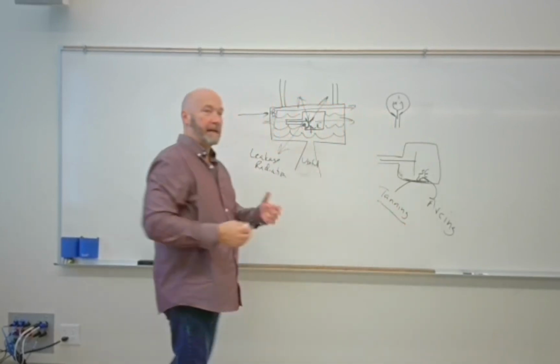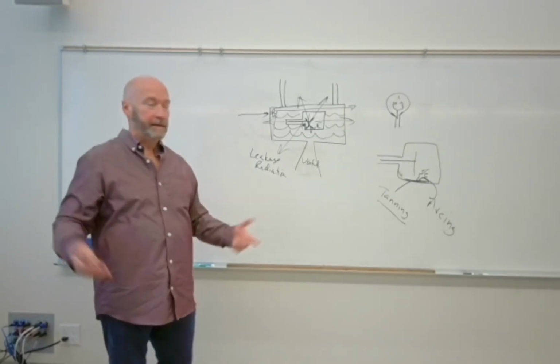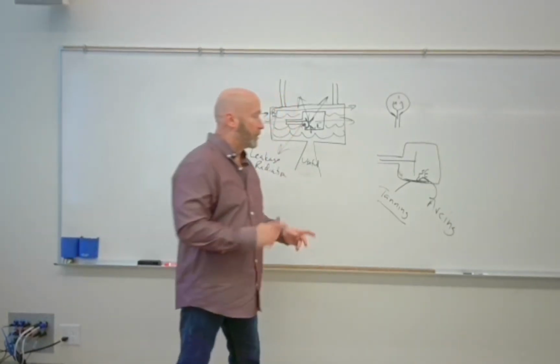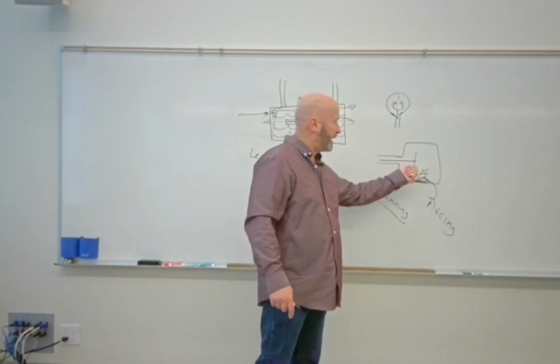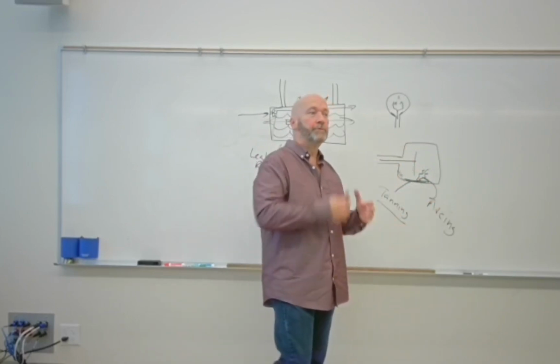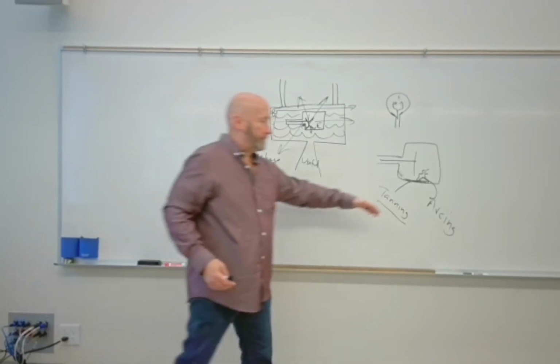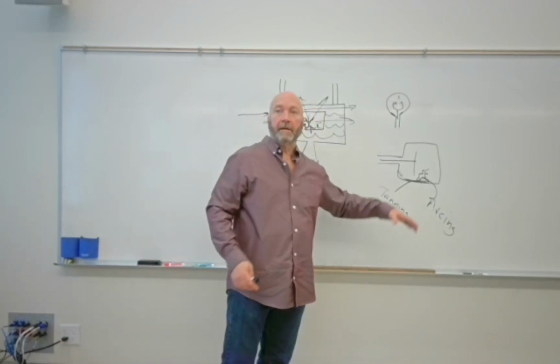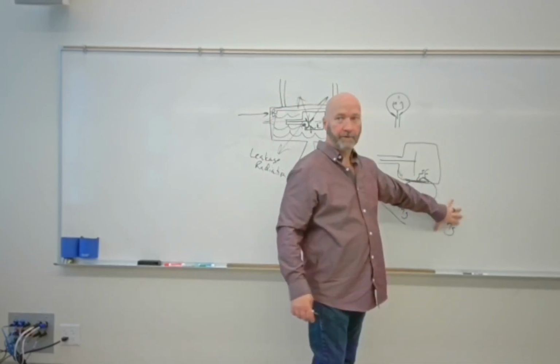Okay? It's tanning of the X-ray tube. Just like, you lay under the sun, you're tanning. Tanning of the X-ray tube occurs as the tube gets older because we melt the filament, possibly a portion of the anode as well, coats the inside of the X-ray tube, changes the imaging characteristics of the X-ray tube, and then eventually leads to arcing.